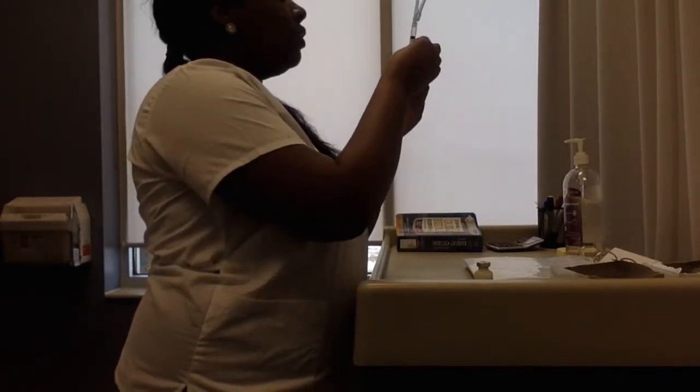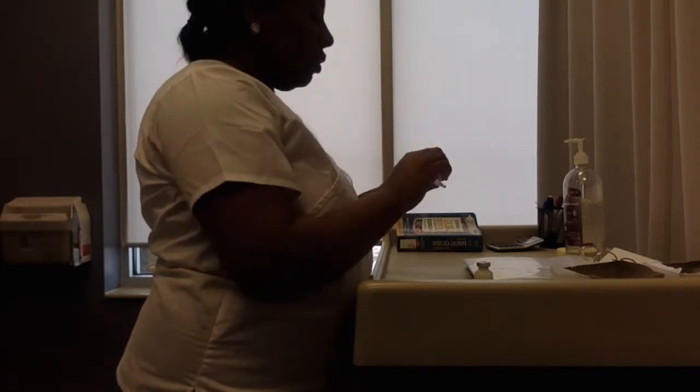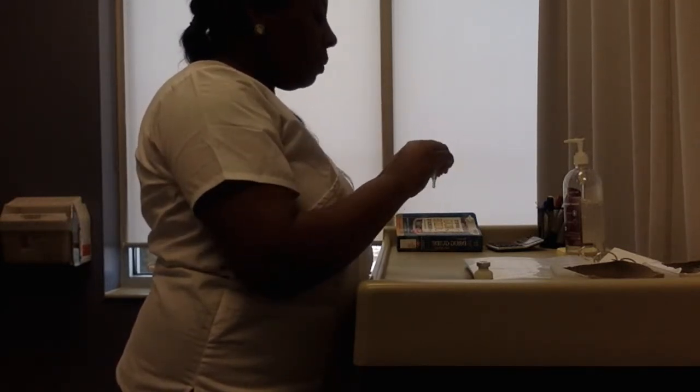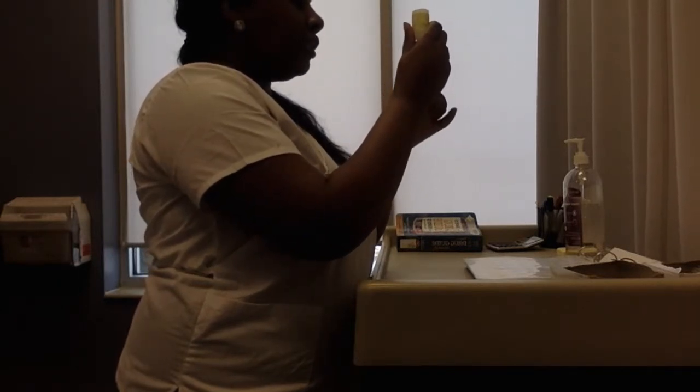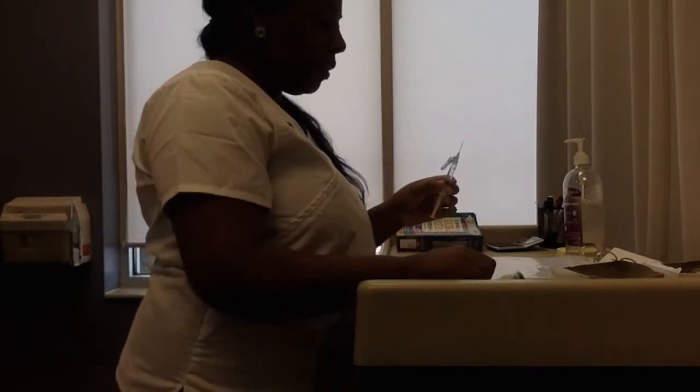Draw some air into my syringe and cap it. So now I'm going to inject my air, invert, and draw out 2 milliliters of my medication. And I want to make sure to tap out the air bubbles. Now I will put my cap back on using the scoop method.